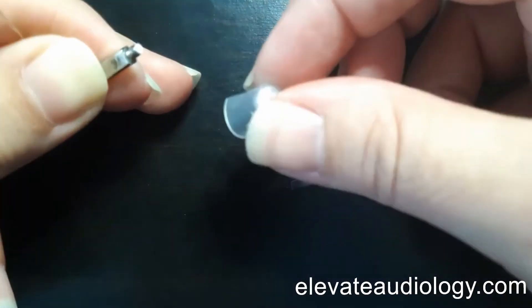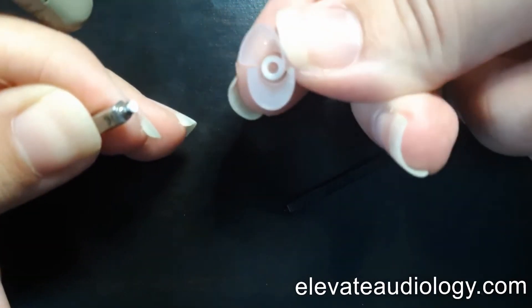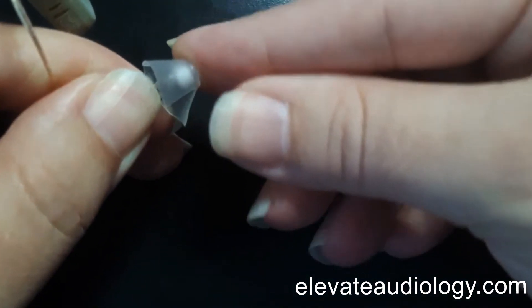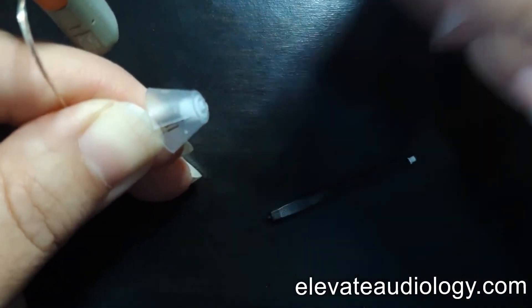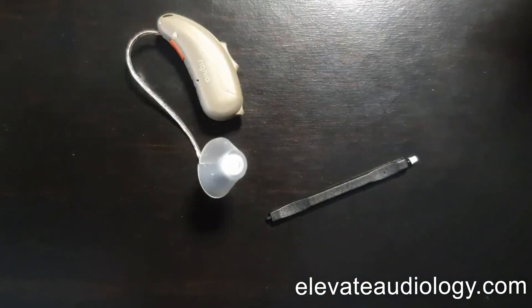You then brush and clean off your dome part. You can see the ring right there — push the receiver into that. You'll hear a click or feel a click if you can't hear it. And then you are done and you've replaced the wax guard for the Signia Ricks style hearing aid.